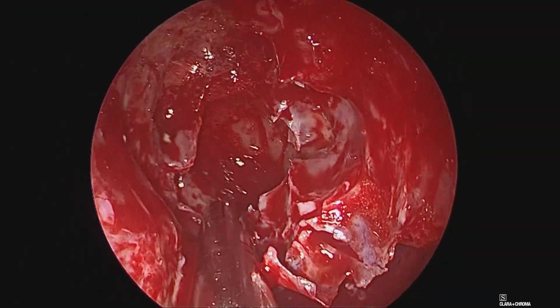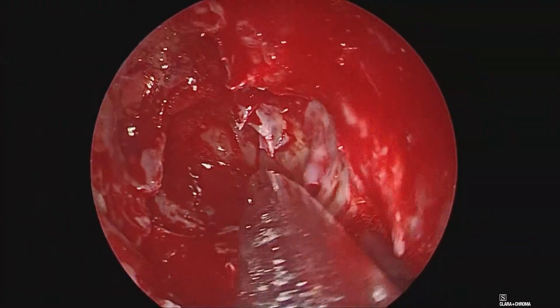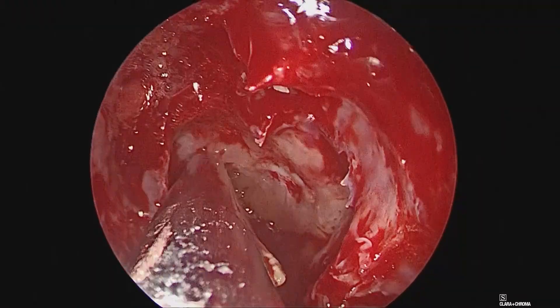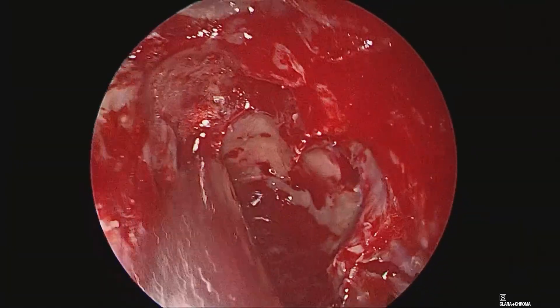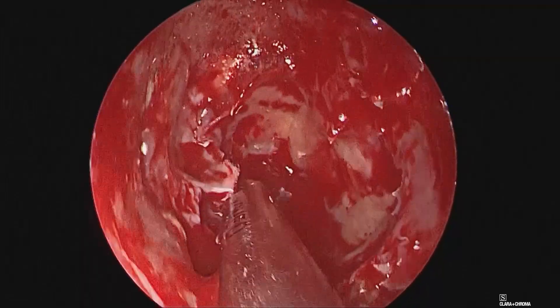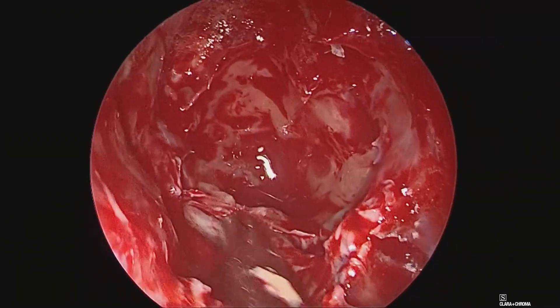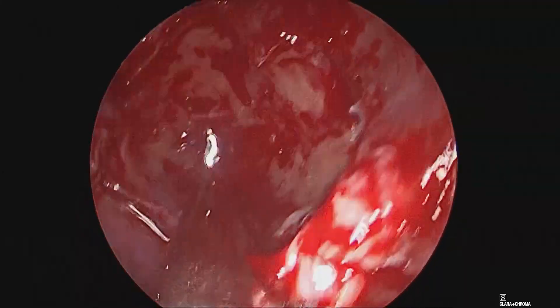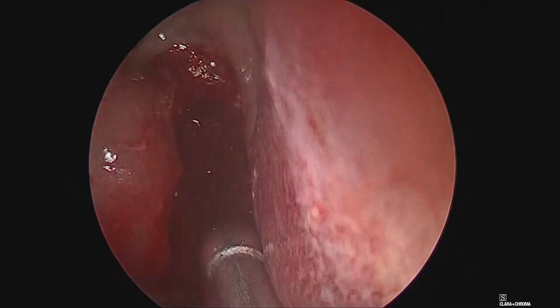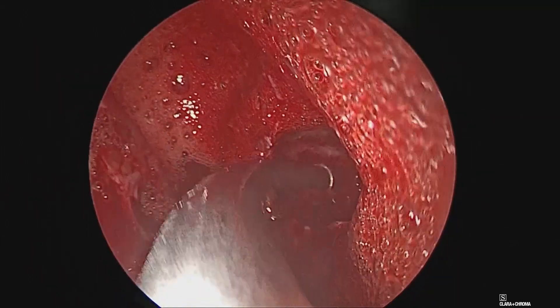The polyps medial to the middle turbinate are now being suctioned away with the microdebrider blade. We can now see the level of the posterior lamina papyracea carefully as well as the skull base, since most of the anterior and posterior ethmoids have been removed. The remaining septations will be taken down to create a smooth cavity amenable to high-volume irrigation for a long time to avoid recurrences. This is the posterior ethmoid cavity — a large cavity — and we have not yet entered the sphenoid.